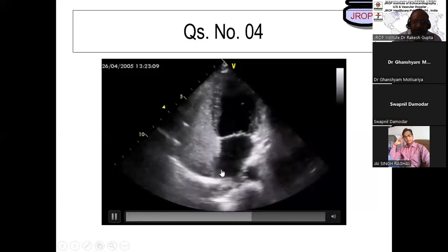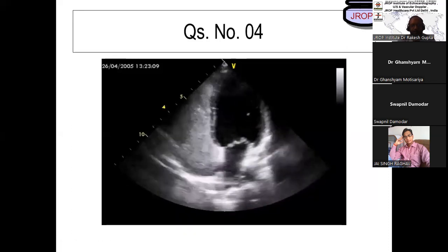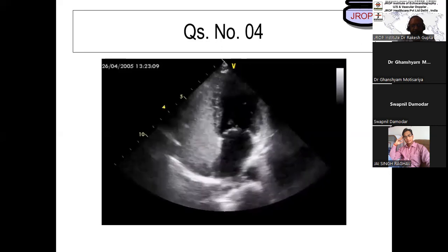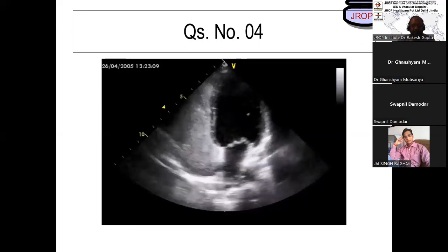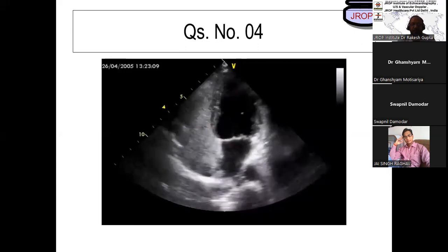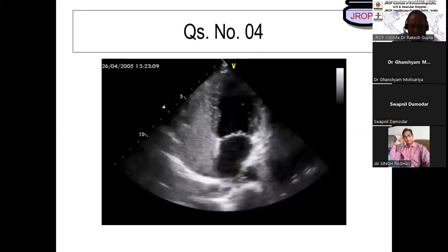Look at over here. In systole, I could see some haziness. That is a left-sided artifact. Forget about that. There's one more thing apart from that. If you get it, 5 out of 4. Is it PFO? No, PFO will always give you contrast shunt from right to left. Okay, I'll give you a hint.